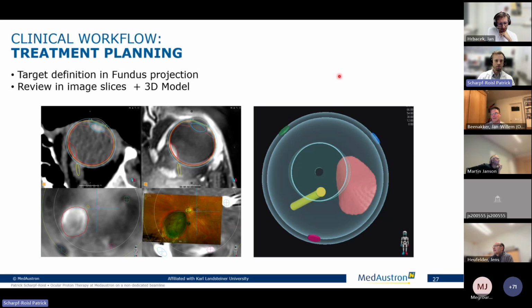We got a script from Martin, which very precisely locates the clips based on the clip artifacts in the CT. And what we get from the CT is the surface of the patient, because we already used the eyelid retractors. First off, we know about the patient's surface, which we can use for those calculations. So we have our entrance surface, and we see the position of the eyelids and where we possibly need to pull further, or if it's even infeasible. If we say the eyelids are pulled already as far as we can in the immobilization, and we still need 5 millimeters, then we would need an additional immobilization, otherwise we'll not be able to pull the eyelids during the dry run.